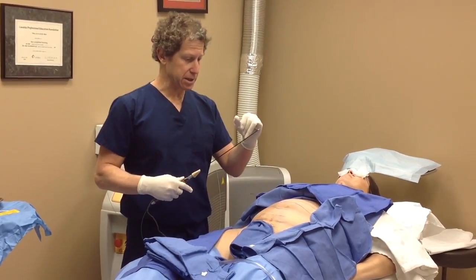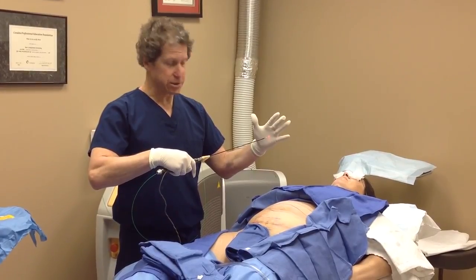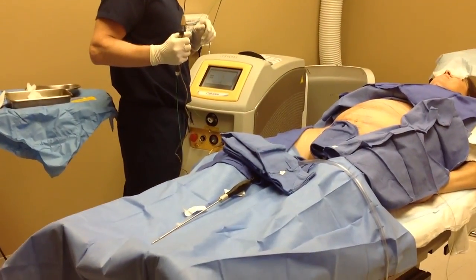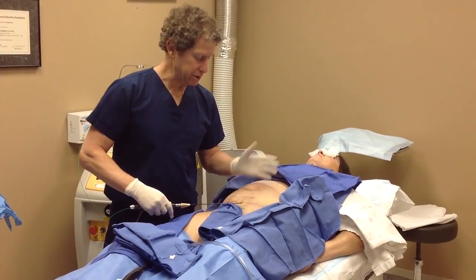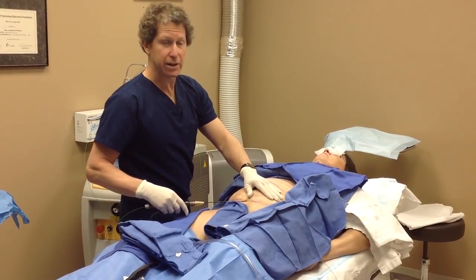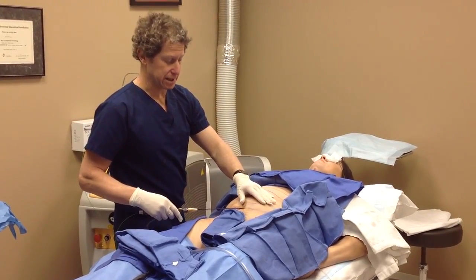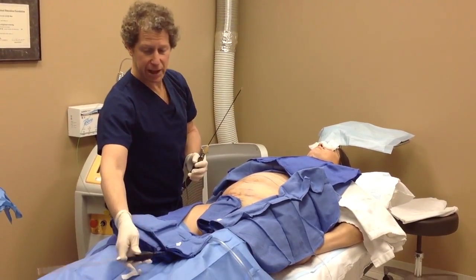This is the laser fiber optic — you can see the little green part extruding and the little red guide light. It's connected to a very wonderful machine by Cynosure, used for SmartLipo and also Cellulaze. She's completely numb, so this will not hurt. I just slip it in — effortless. I move it back and forth, stepping on the pedal to fire the laser, which is melting fat and also heating up the skin so you get some degree of skin tightening. Then I'll take it out and introduce the liposuction cannula to suck up the melted fat.